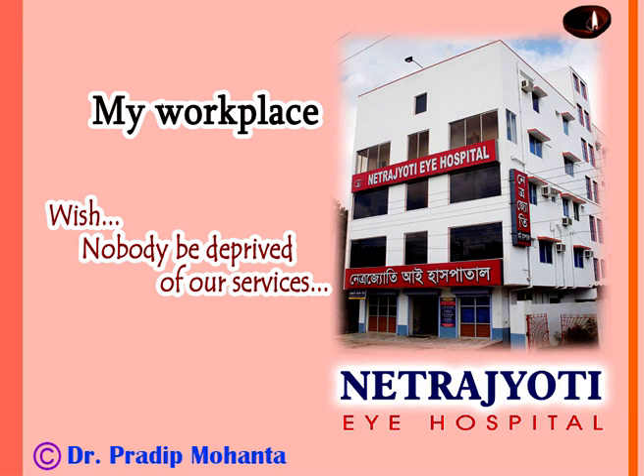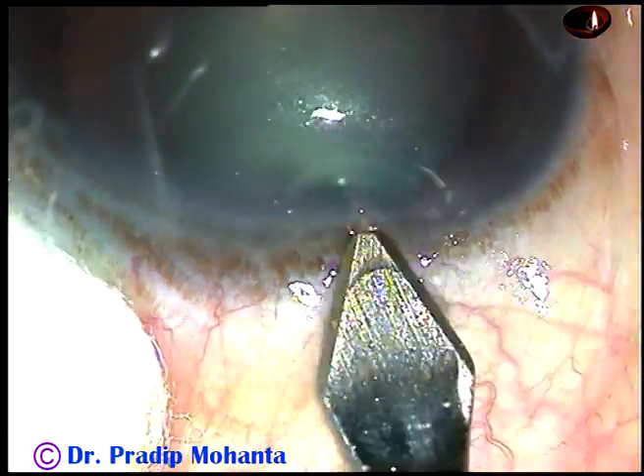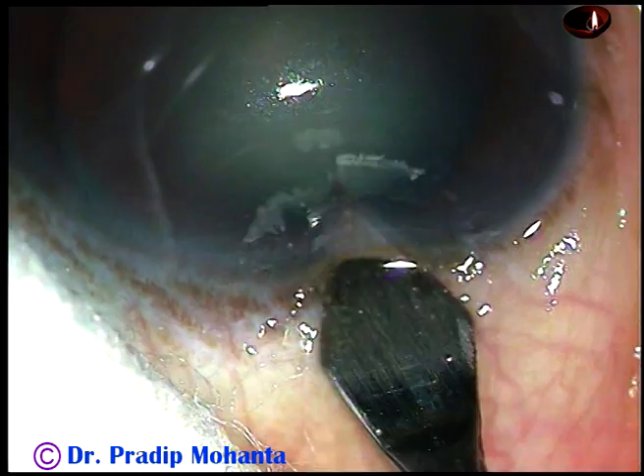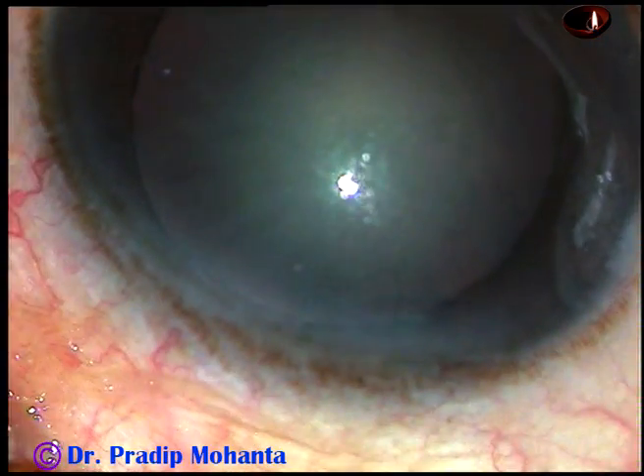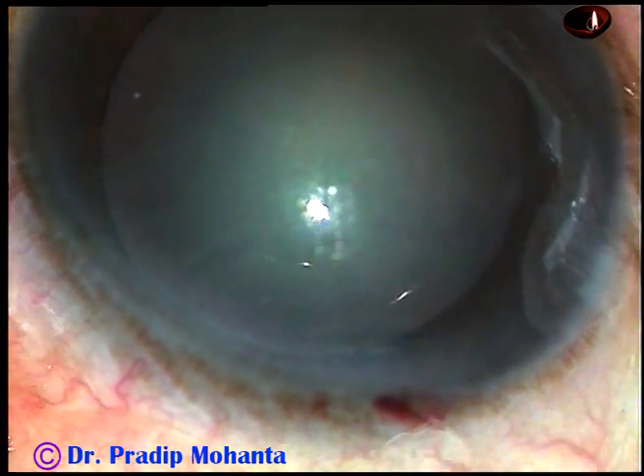Friends, welcome to my workplace at Rana Ghat, West Bengal, India. This is a very soft cataract. Nucleus sclerosis in this case is grade 1 plus or grade 2. Let us observe the management of this case.